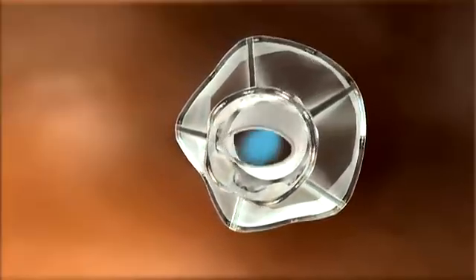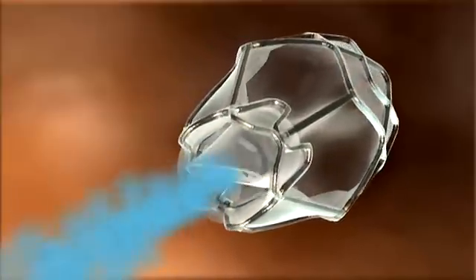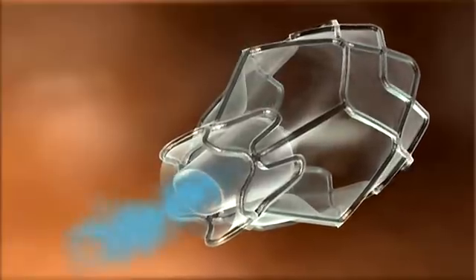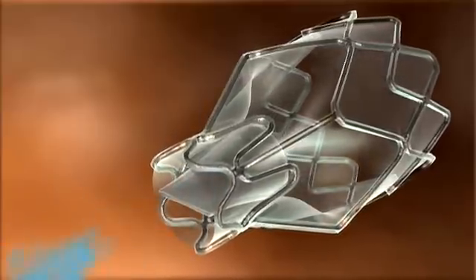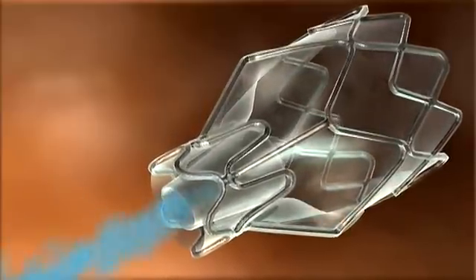The device consists of a one-way silicon duckbill valve, precisely engineered to open at low pressures, but close quickly when the airflow direction is reversed.